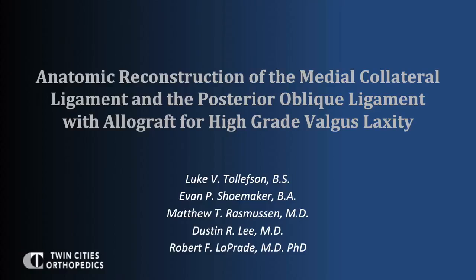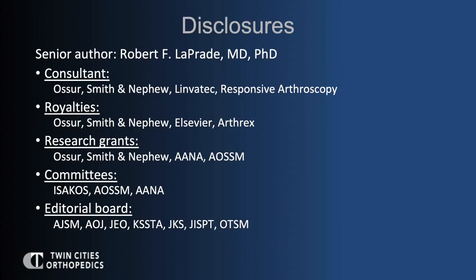This is a video technique for an anatomic reconstruction of the medial collateral ligament and the posterior oblique ligament with allograft for high-grade valgus laxity.